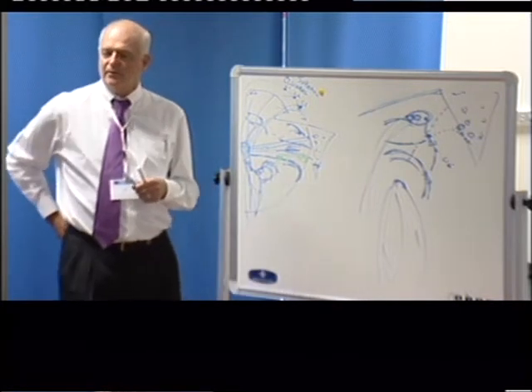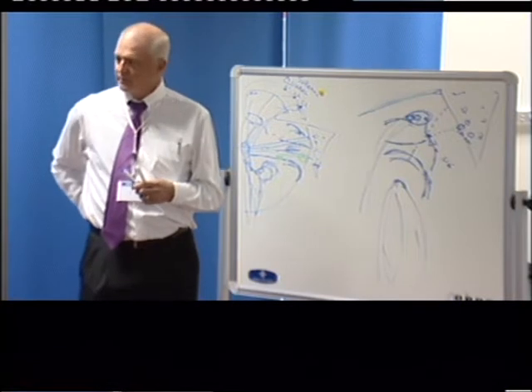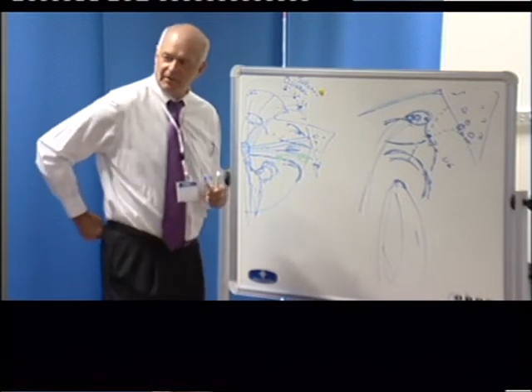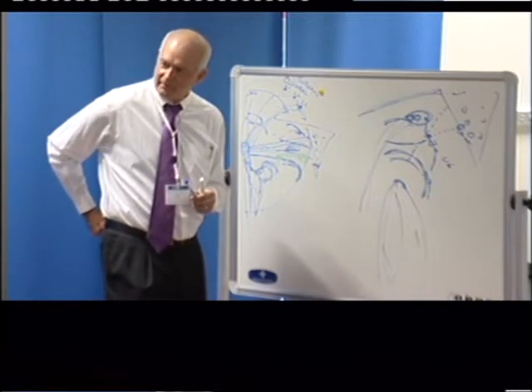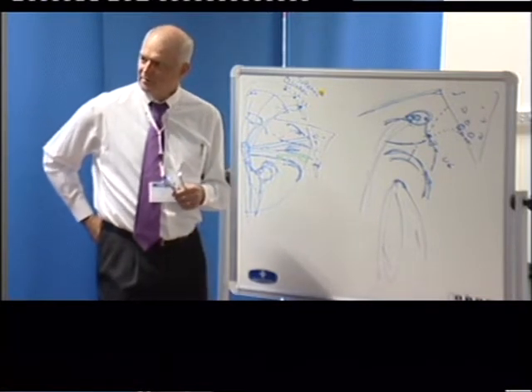And then everybody thinks it's the sacroiliac joint. You do the sacroiliac joint, and it really doesn't help. It's just on the PSIS, the posterior superior iliac spine, not the sacroiliac joint, just lateral to it, right there. Can you see them on ultrasound?